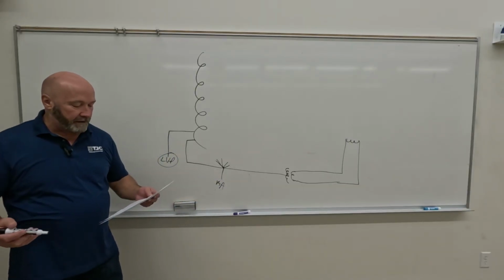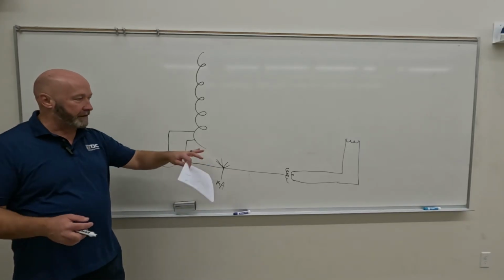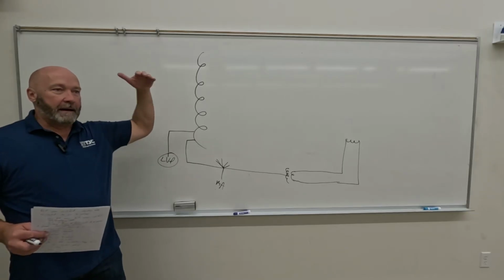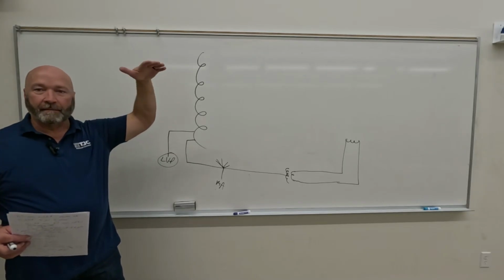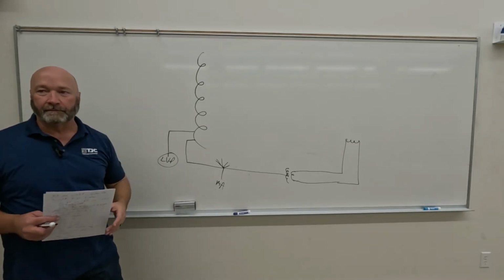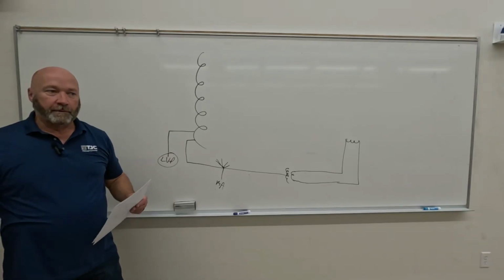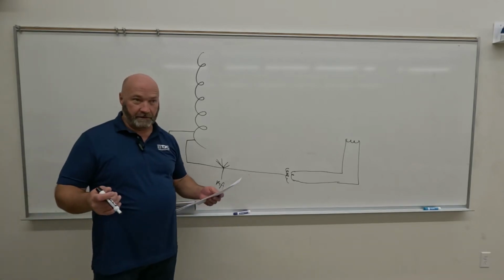Then we talked about the falling load generator. It's kind of a weird place for it in all this, but the falling load generator was the type of x-ray machine that would start at the highest amperage possible, and it automatically selected your mA throughout the exposure so that it would drop throughout the exposure. The purpose for that was to reduce the exposure time to as short as possible. So, any questions on that?